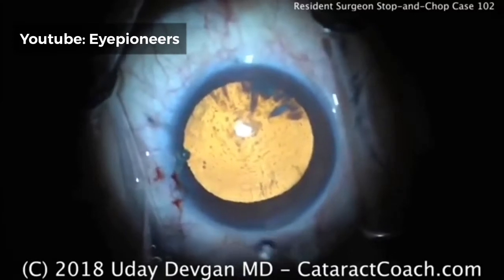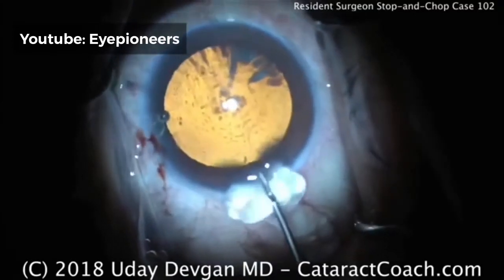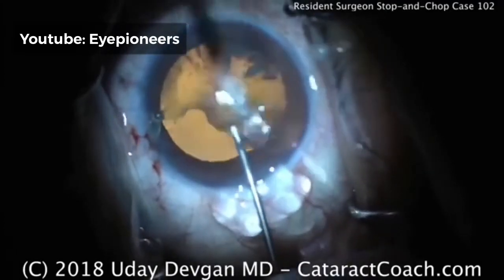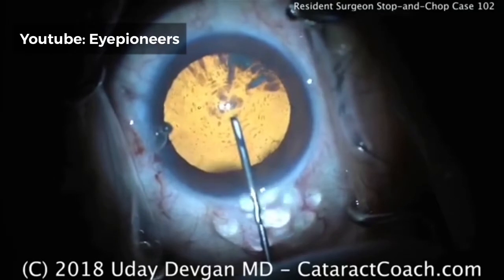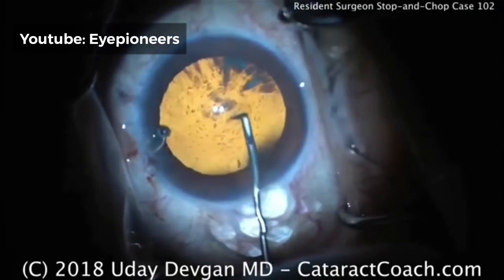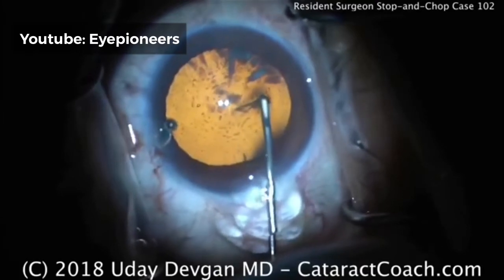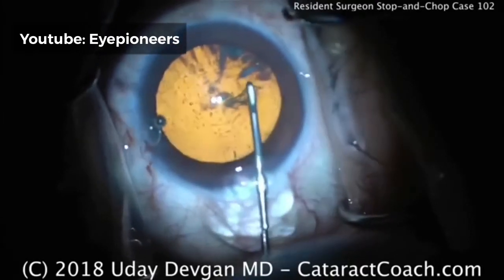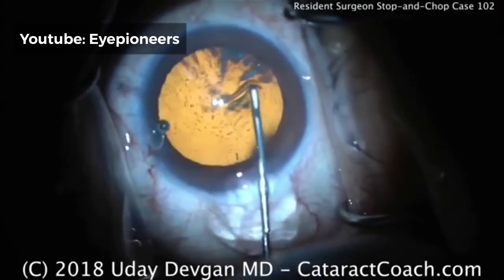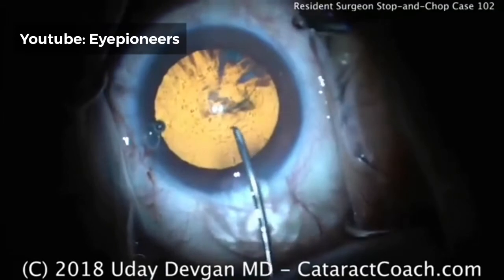The resident is choosing to use a cystotome to start the rhexis. Again, look at the viscoelastic that exits the eye — that's common for the cohesive; it stays together in a big bunch. Cutting across with the cystotome and attempting to flip over the edge — there's an edge right there, and there's the flap turned over, coming out of the incision.